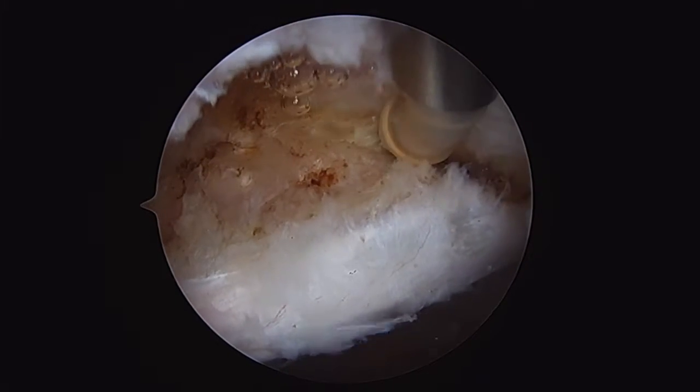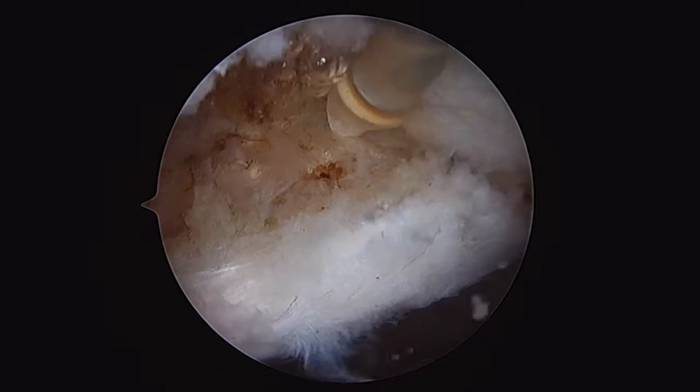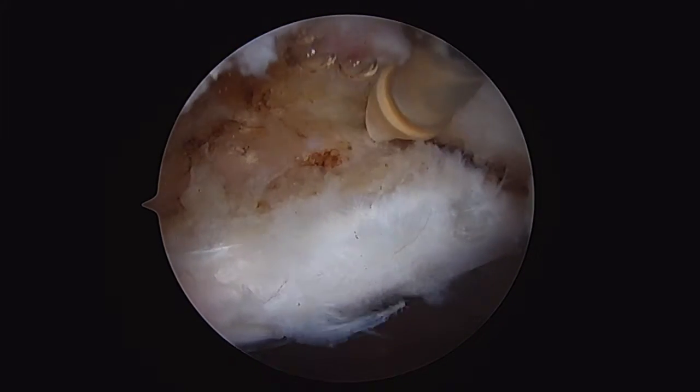Hi, this is Dr. Chris Doyle from Bentonville, Arkansas. Here I'm going to demonstrate the use of the 2.8mm Parkus knotless anchors for labral repair in the hip.